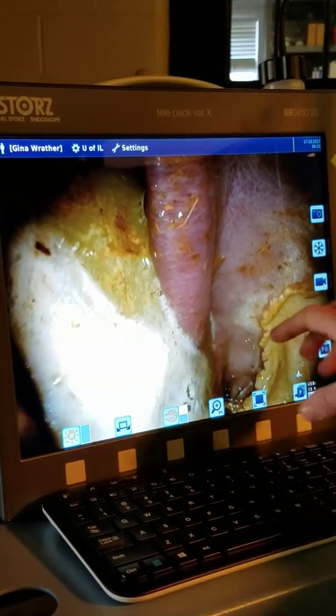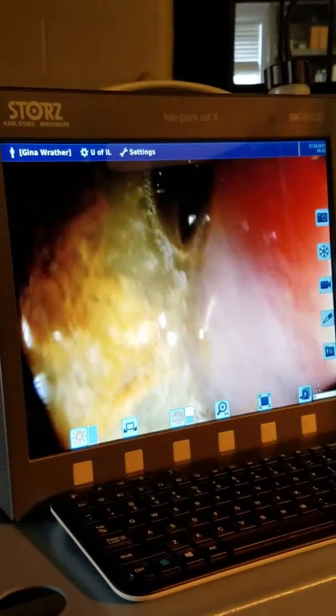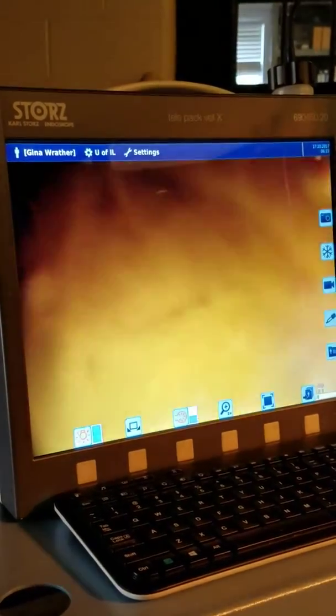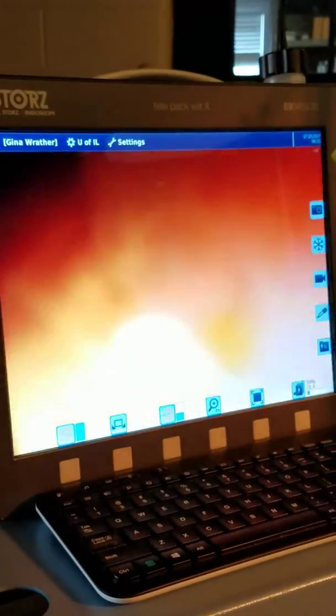We call this the lesser curvature because it's just smaller. They just follow you in there.